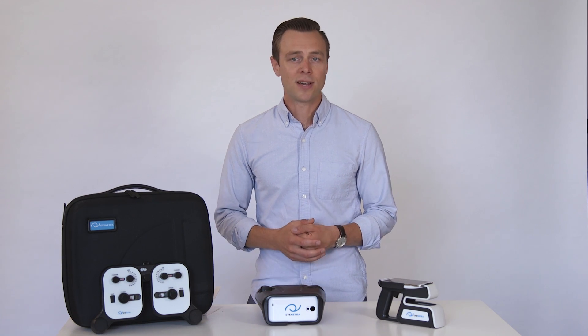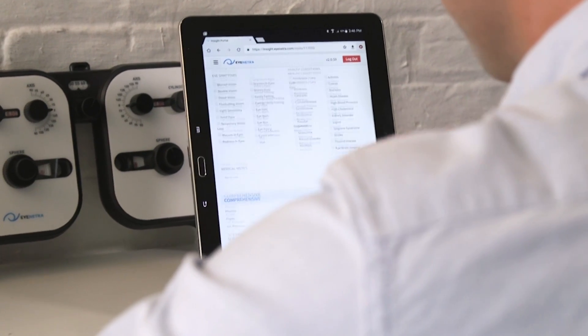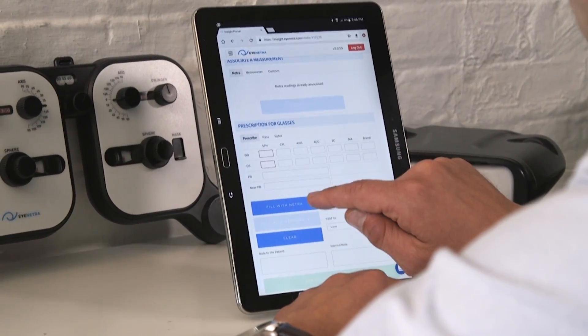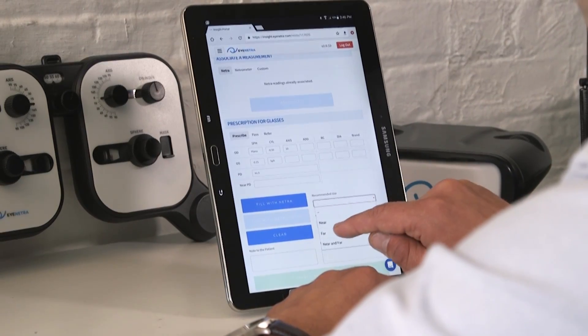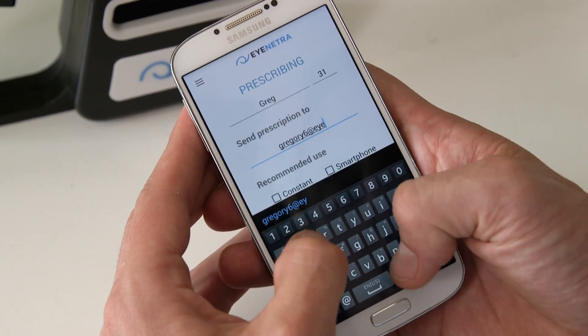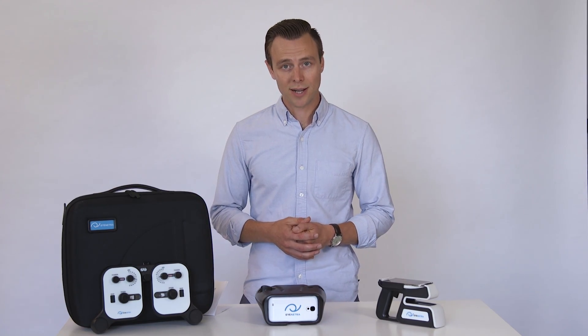Now, if you already have a tablet or a laptop, setting up a mobile clinic has never been easier. The Insight Portal seamlessly integrates with the iNetra devices. A monthly subscription allows you to set up vision testing events, send digital prescriptions, and even bill your patients from any connected tablet or laptop. With your briefcase and a tablet, you're your own walking mobile clinic.